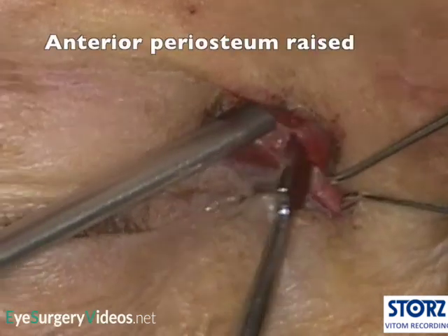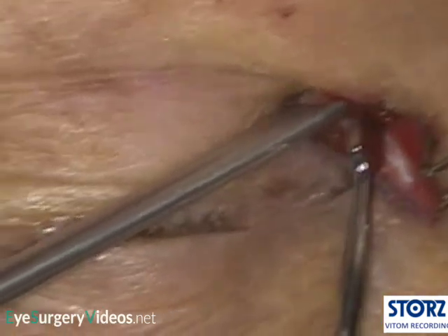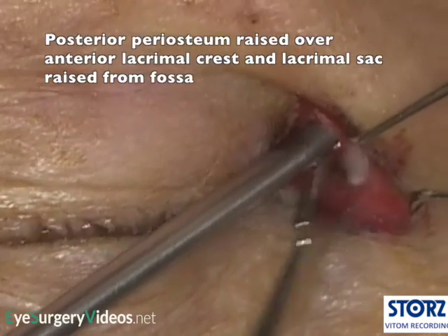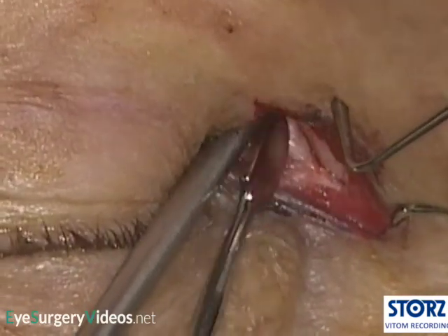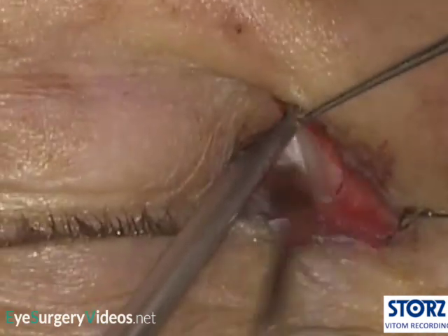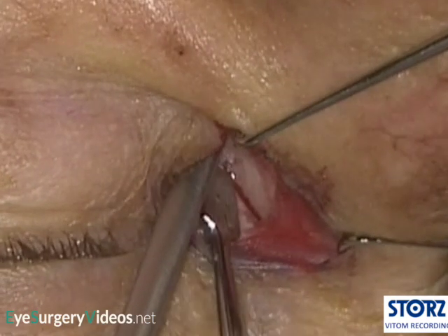The periosteum is opened along the full length of the incision just anterior to the anterior lacrimal crest. This can be commenced at the defect created by disinsertion of the medial canthal tendon. The periosteum is raised from the underlying bone with a small periosteal elevator, such as a Rollet's rugine, both anteriorly and posteriorly. Anteriorly, a few millimeters should suffice to provide good exposure and ensure the periosteum will not be trapped in the rongeur during formation of the bony ostium.